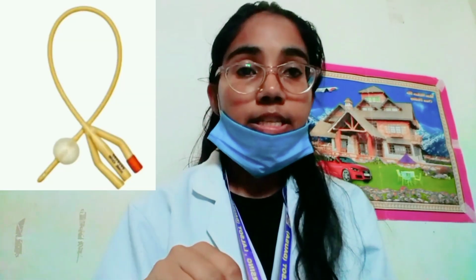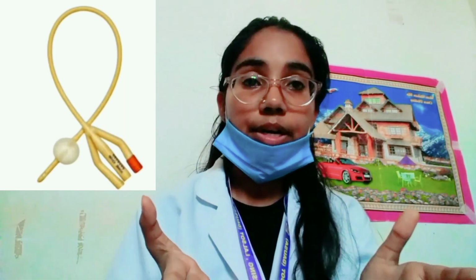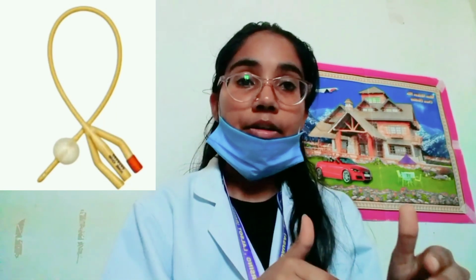So the fourth one is the three-way Foley's catheter. This catheter is used in those patients who require continuous or intermittent bladder irrigation, and here the third lumen is used for irrigating sterile fluid into the bladder, and then the fluid exits from the bladder into a drainage pot. Okay, and now the size of the catheter.